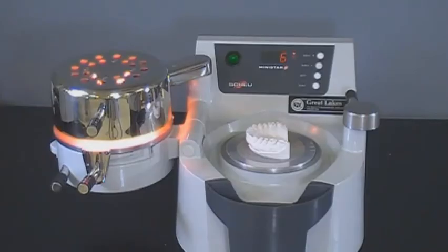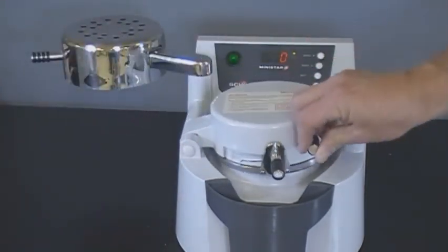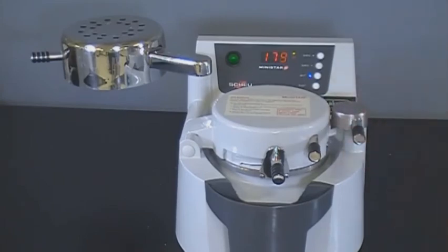With 5 seconds remaining in the heating cycle, a series of beeps will occur. Then at zero, a continuous beep indicates the end of the heating cycle. Remove heat over material and rotate chamber over model on platform. Lock chamber in place to pressurize. Allow formed material to cool under pressure for 3 to 5 minutes.